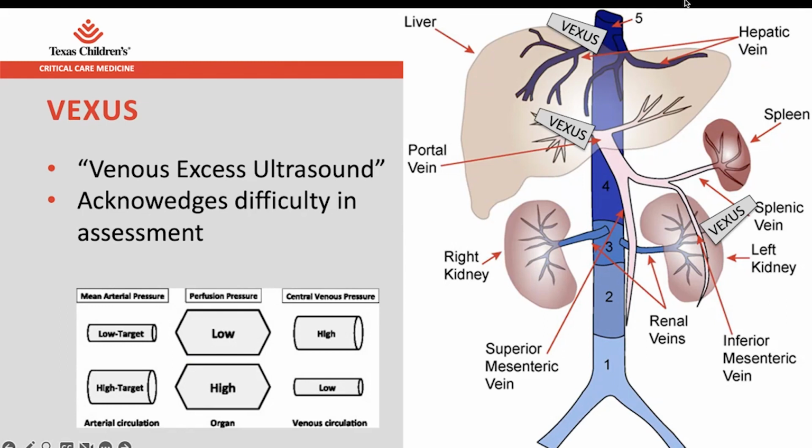So the idea was, let's take a look in a couple of different places in the belly. Let's look at the IVC to get a good sense for where we are in terms of what we can generally characterize as maybe our ballpark fluid status, though clearly knowing there are some caveats to that. Let's look at the portal vein to look at the splanchnic perfusion.